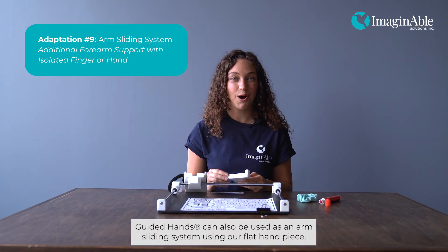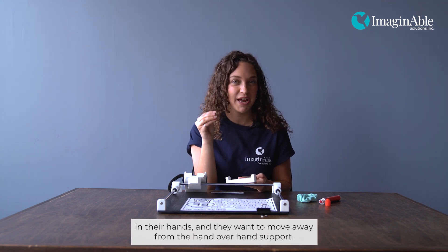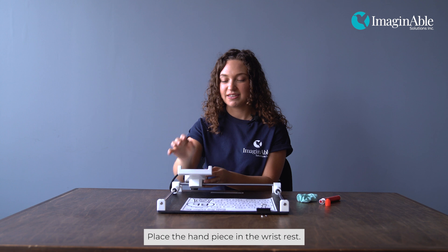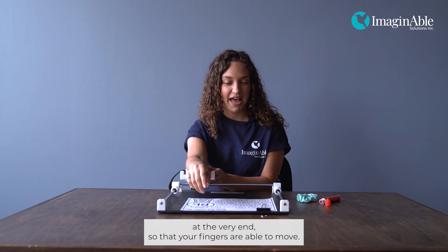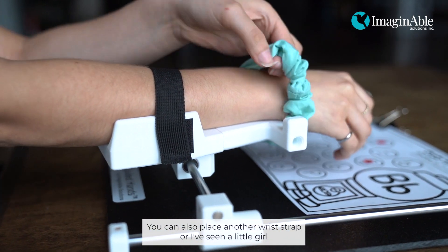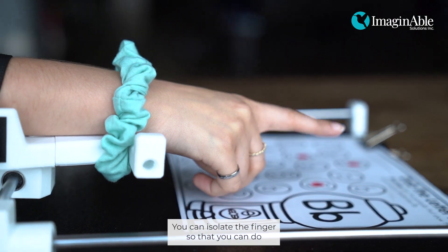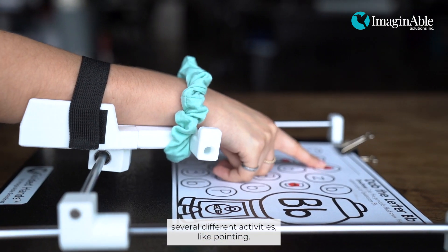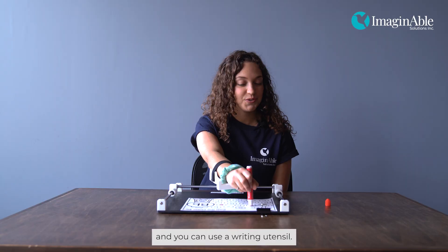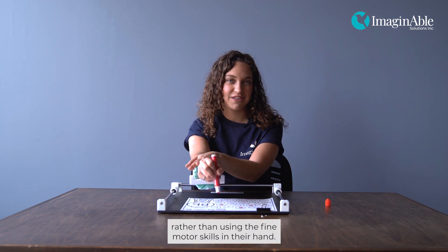Guided Hands can also be used as an arm sliding system using our flat handpiece. This is a great adaptation for individuals who still have some fine motor skills in their hands and want to move away from hand-over-hand support. Place the handpiece in the wrist rest and place your arm in the holder with your wrist at the very end so that your fingers are able to move. You can also place another wrist strap — or a scrunchie at the wrist — to keep the arm more secure. You can isolate the finger to do several different activities like pointing, navigate the iPad, or use a writing utensil. This encourages the individual to use gross motor skills in their shoulder rather than fine motor skills in their hand.